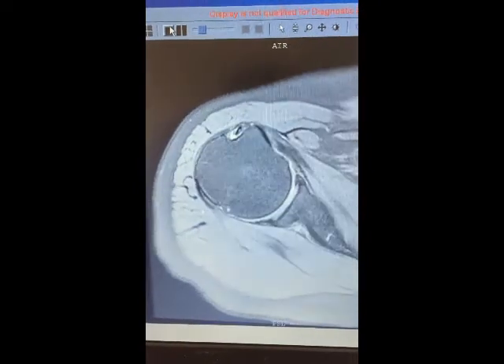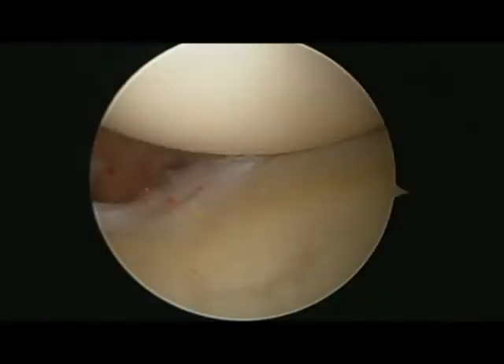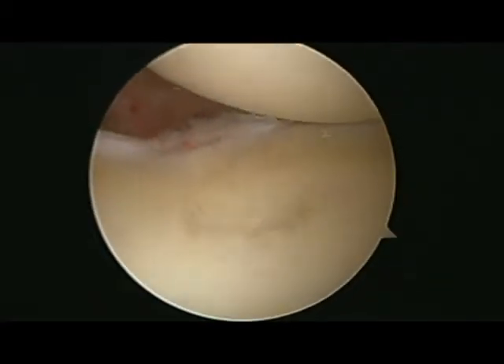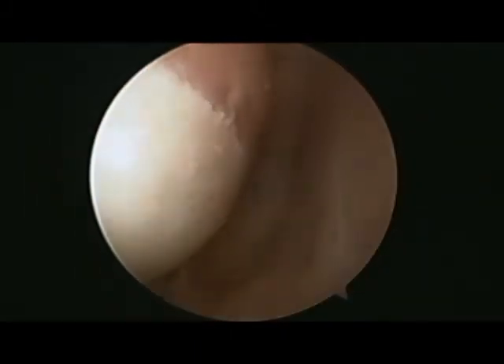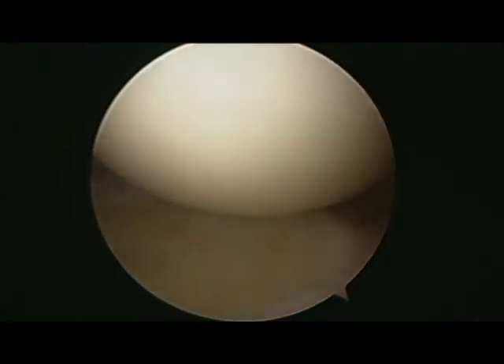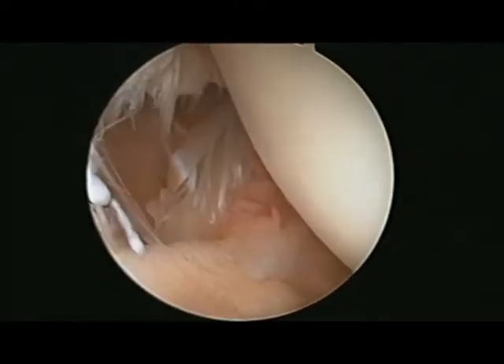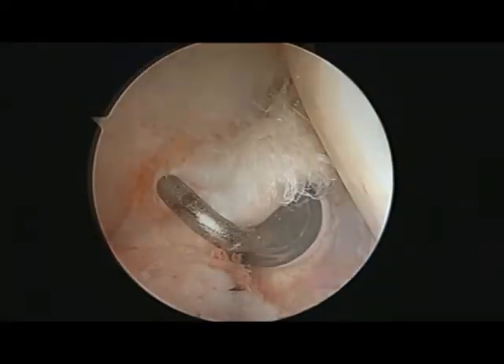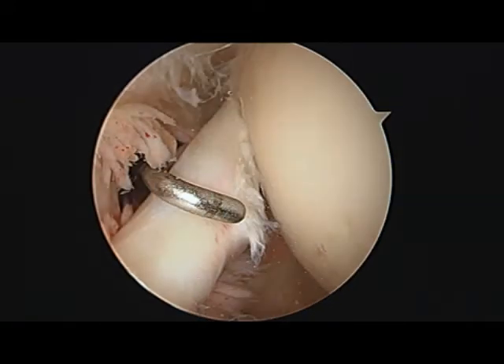Arthroscopic findings confirm my suspicions that the biceps was partially torn and the subscapularis was torn. This is an intraoperative video. You're looking at the cartilage of the humeral head. That's the infraspinatus, the rotator cuff muscle insertion there. We'll see the supraspinatus insertion there. That's the biceps that we're looking at, and looking down at the subscapularis — that looks abnormal. These are a couple of still shots of the abnormal and partially torn biceps.